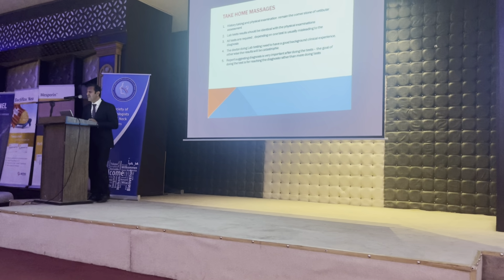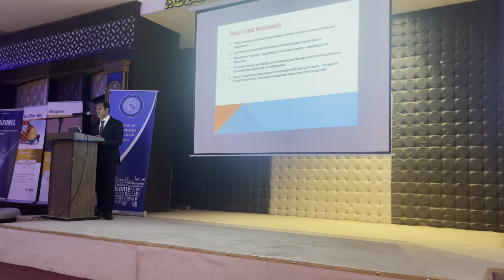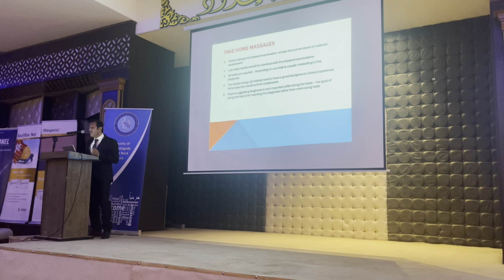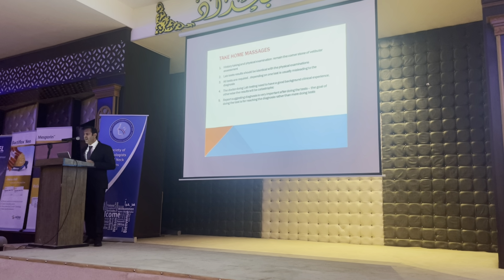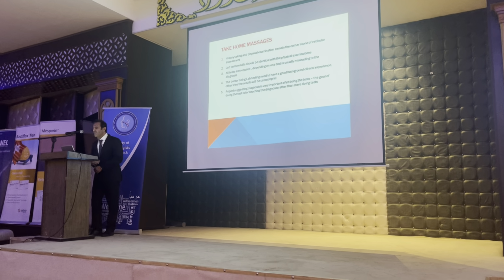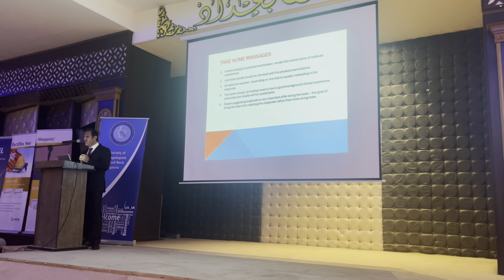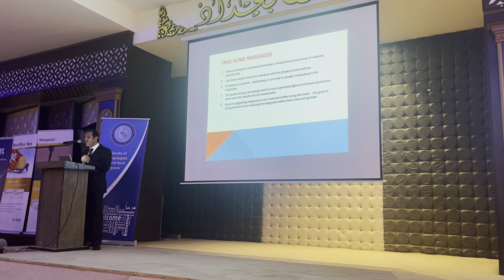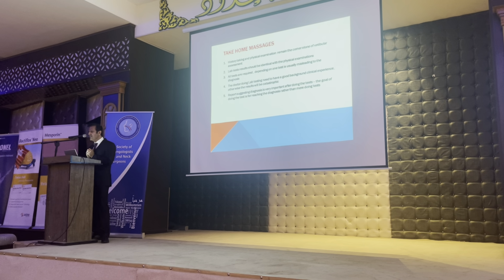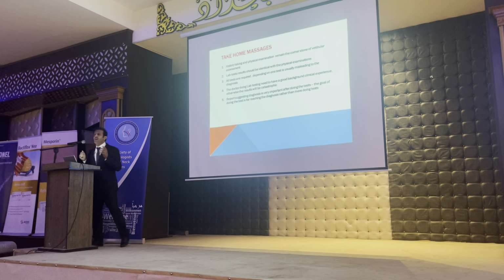All tests are required; depending on one test is usually misleading to the diagnosis. A doctor doing lab testing needs to have a good background of clinical experience, otherwise the result would be catastrophic. Reports suggesting a diagnosis are very important after doing the test. The goal of doing the test is reaching the diagnosis rather than doing the test itself.